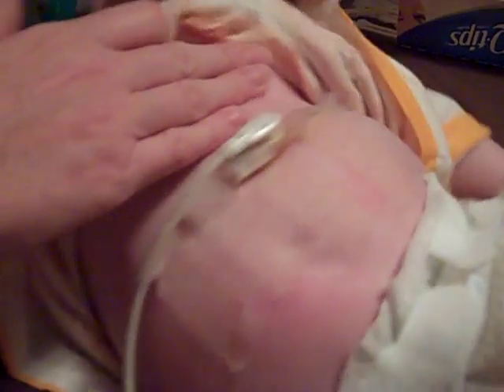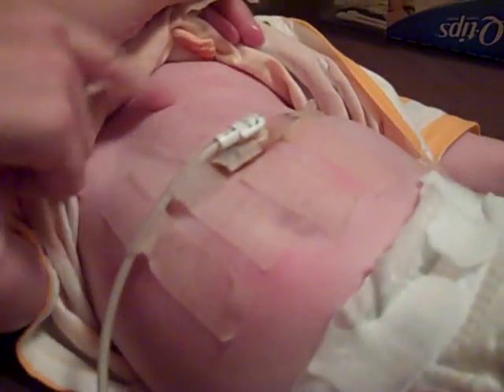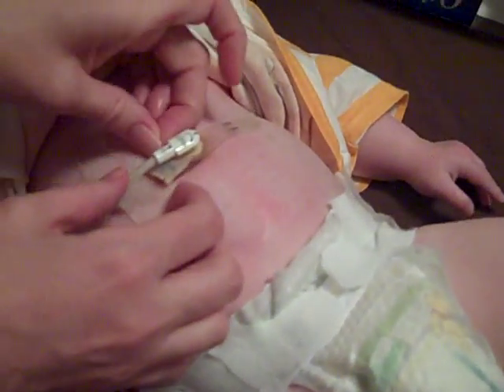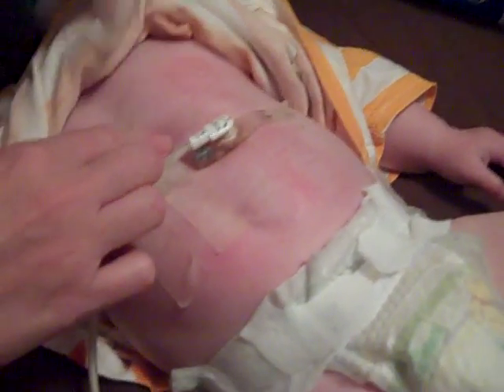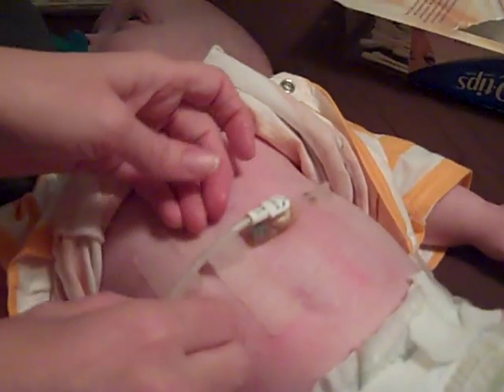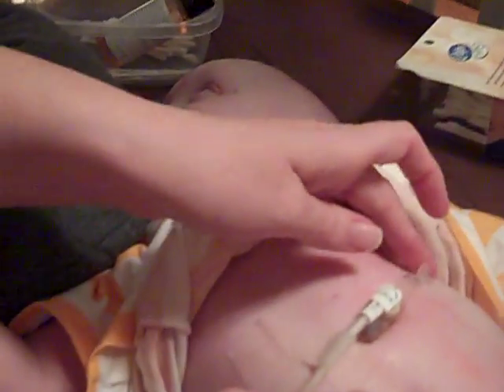And you can kind of see Benjamin's tummy is full of that adhesive stuff, because it's a little bit hard to get it off. So anyway, but that adhesive remover just helps it come right off. So what happens with this tubing after we leave it on for a week or a week and a half, like I said, it starts to harden up. And the problem with it is when I move it, see how that moves?